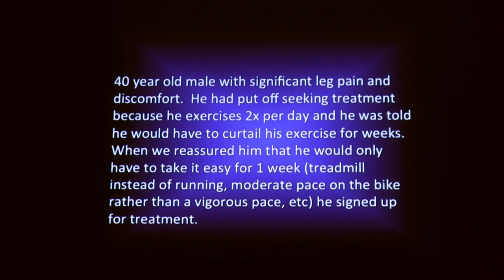Yes? Two questions. When one comes in for an initial appointment, do you do the testing then? No, I do not. I personally do not. There are people out there that do. There are people out there that will do a free consultation with a brief, put the probe on, etc. I don't. I'm more detail oriented than that maybe, and I take my time maybe, and I also like to go through a routine process of a complete physical examination, and then my ultrasound exams that we do at our facility are really detail oriented. So we don't do what you're describing.